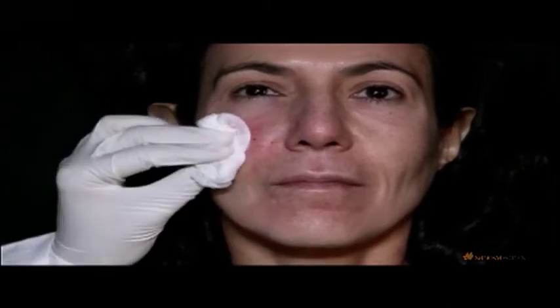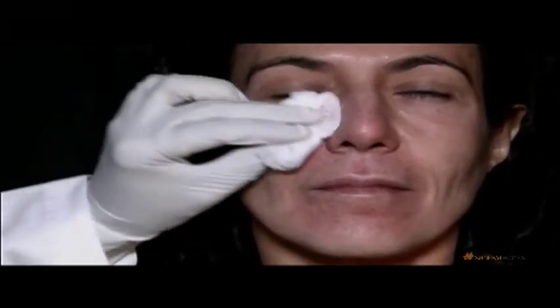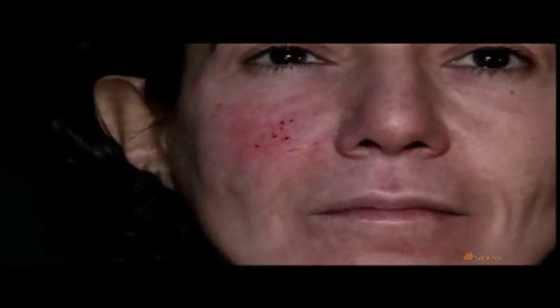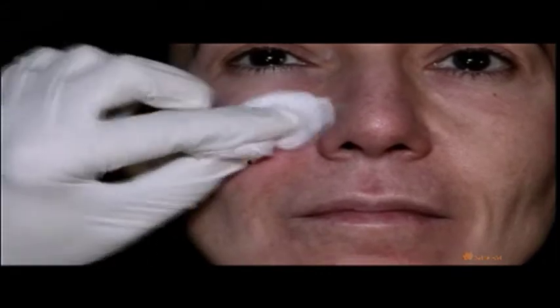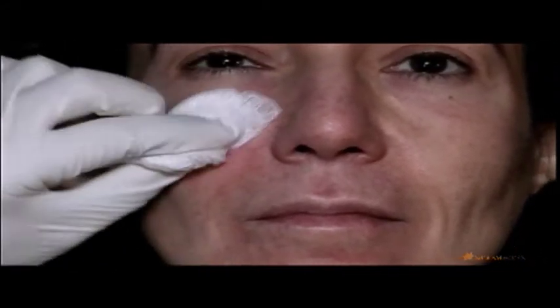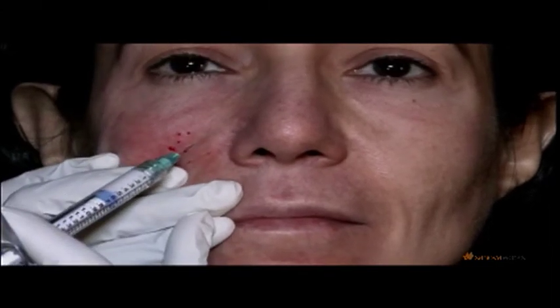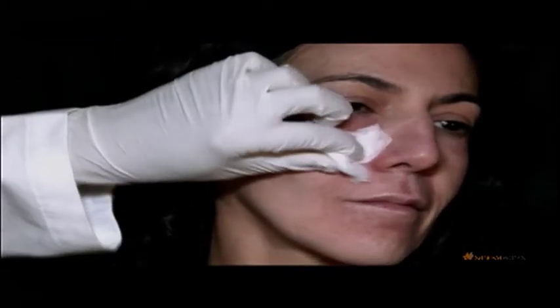And remember, it's not all about cannulating a vessel inadvertently. What we perhaps even need to be even more concerned about is compressing a vessel. This is another advantage of using a high G prime filler, because we only have to inject a relatively small volume, so I feel we're at less risk of actually inadvertently compressing a vessel. What I want you to see now is if we look at Katya after injection of about half a syringe of the Radiesse. If I turn her face, can you see the difference here with the side that I have restored volume to compared to the other side?